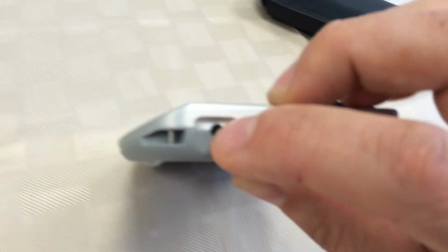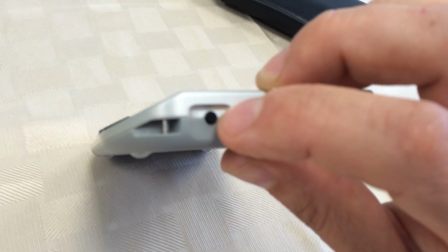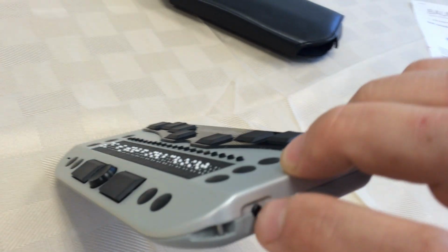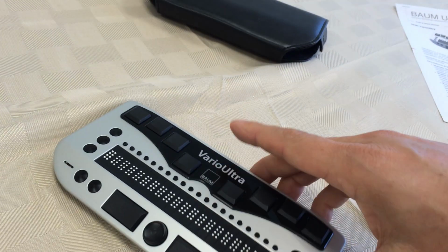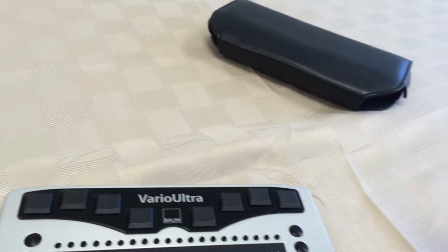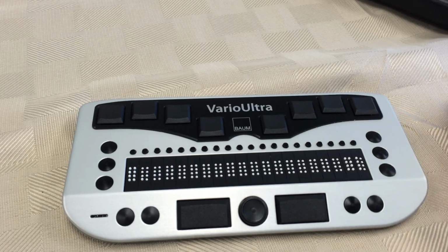And then one more thing to show you, and that is a recessed button on the right-hand side of VarioUltra. This is the power button. So if you just press it once, VarioUltra will go into a standby mode. If you press it and hold it down, it can switch it off. And if you press and hold it for a really long time, it will actually do a full reboot.